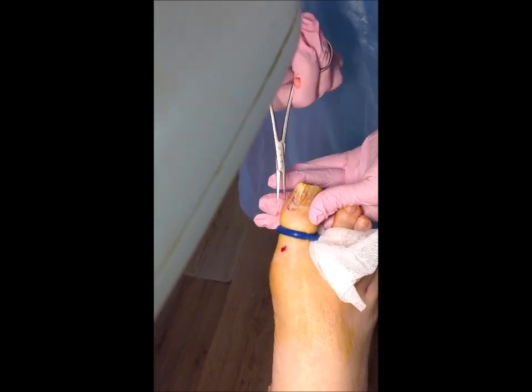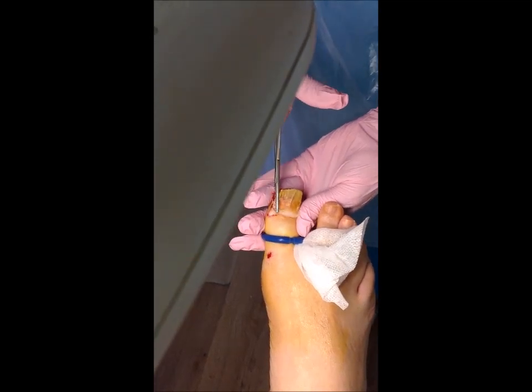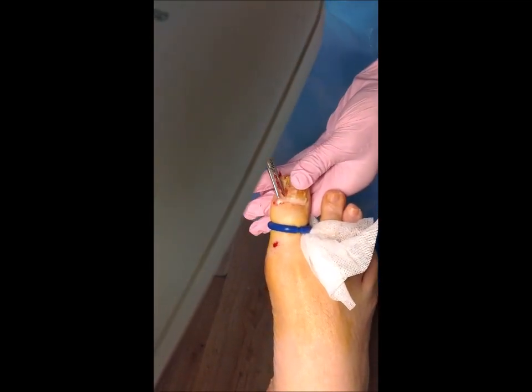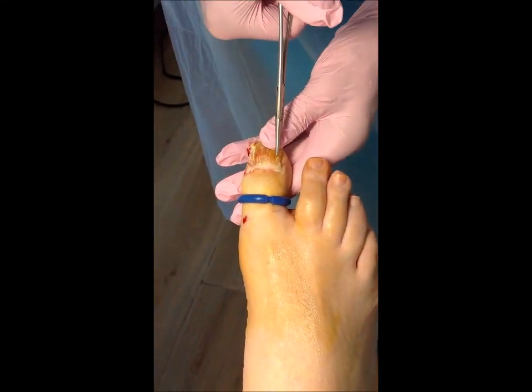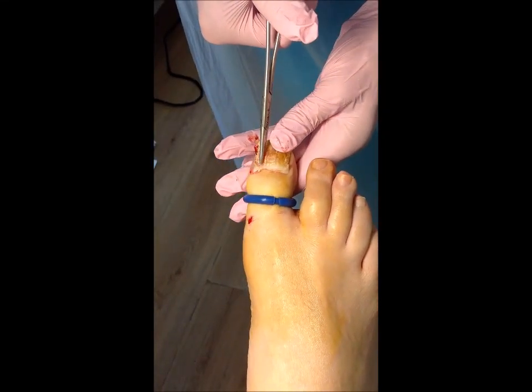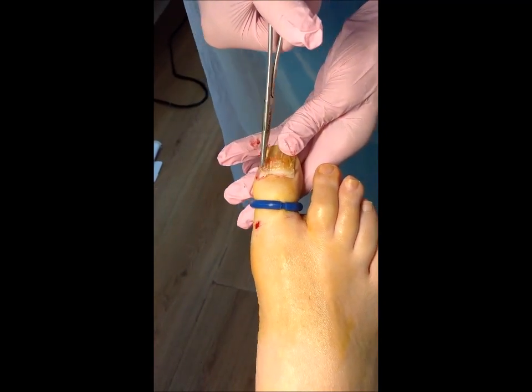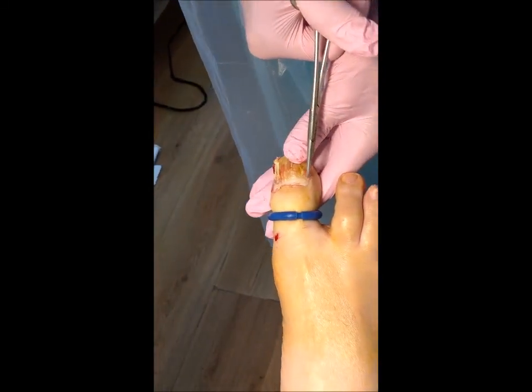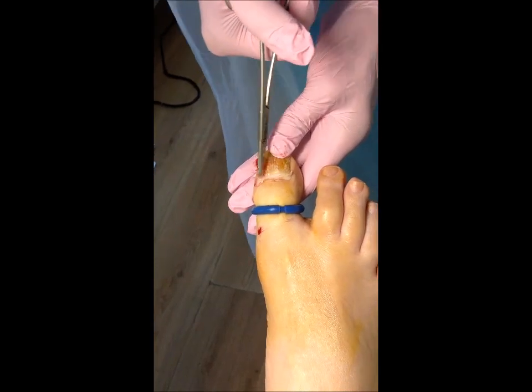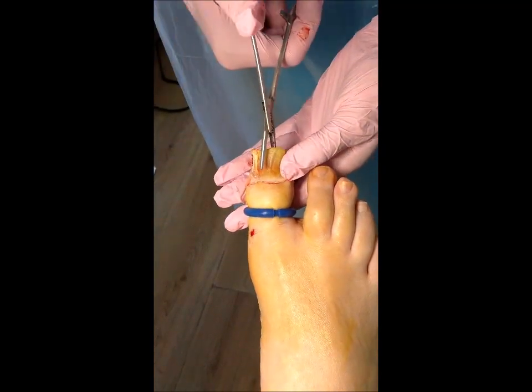Now interestingly, if we can get the camera closer — you can see where the infection is just invading the matrix. All this is the new nail being created, and you can see how it's wanting to get in there. At this point it's really invaded into the matrix, and this is what you need to treat underneath to really get a good result.